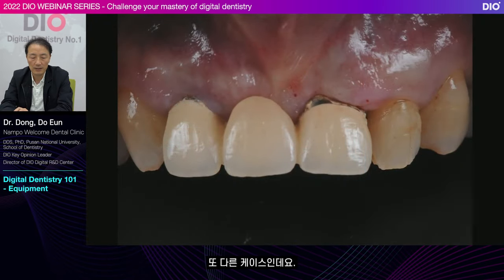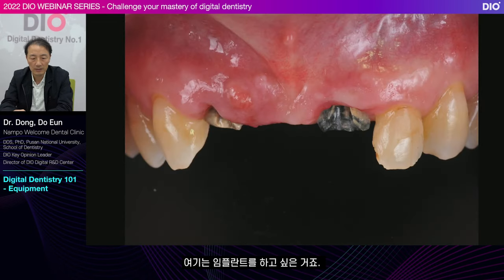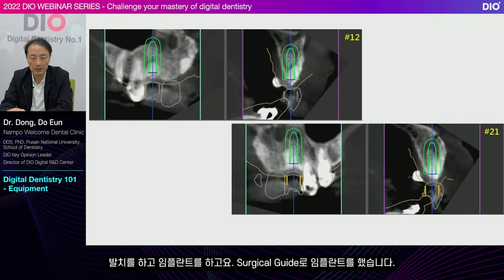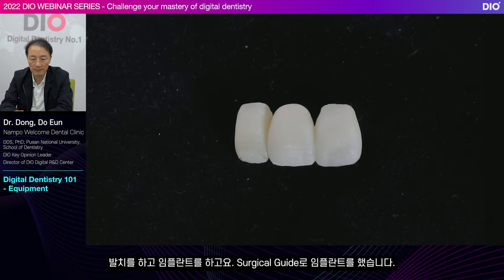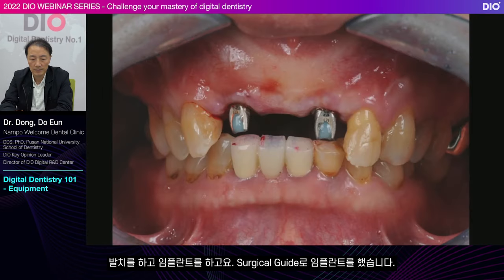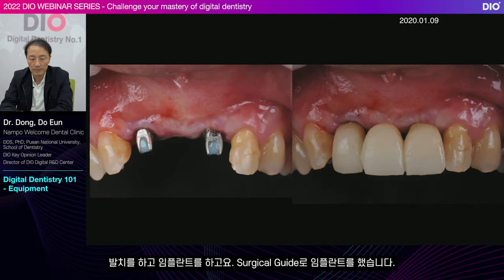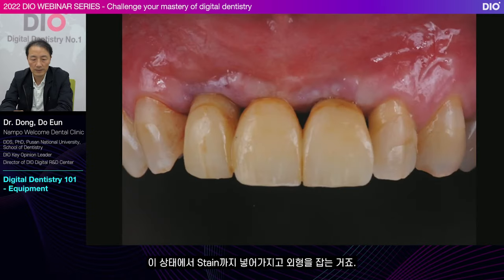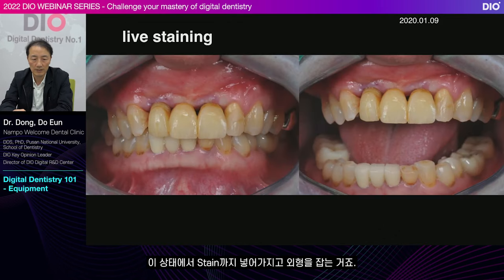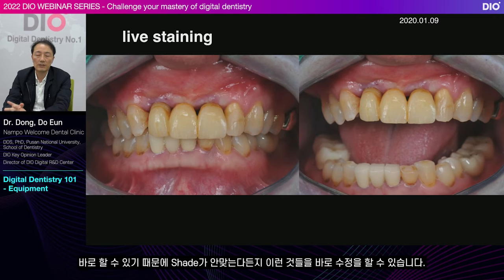This is a different case. This is a case done by one of DO R&D directors Jung Dong-gun. He wanted to place an implant here, so he extracted and placed the implant using a surgical guide. This is with the provisional loaded. You put stain in this state and form the external shape. This can be done in the mouth directly at the chair side. So if the shade doesn't match, it can be corrected right away.